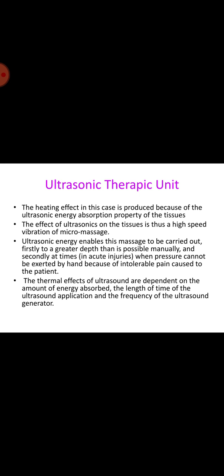The heating effect in this case is produced because of the ultrasonic energy absorption property of the tissues. The property of specific heat distribution in tissues or the additional effect of a mechanical component have given rise to a number of special therapeutic applications of ultrasonics. The effect of ultrasonics on the tissues is thus a high-speed vibration or micromassage.